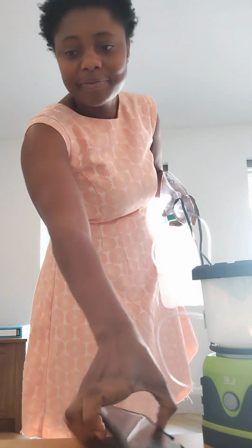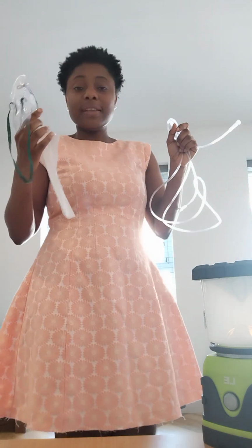Okay, so I pick my mask. So I'm going to use this as my patient, alright? Okay, so in the exam, if it comes, it will be a part of the exam, okay? So examiner, I'm going to assemble my reservoir mask to the tubing.